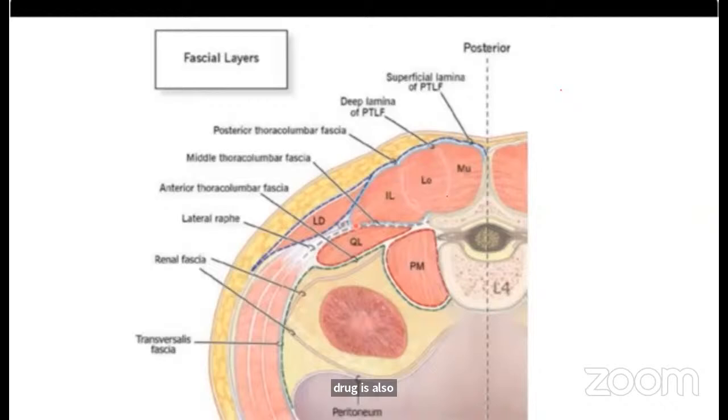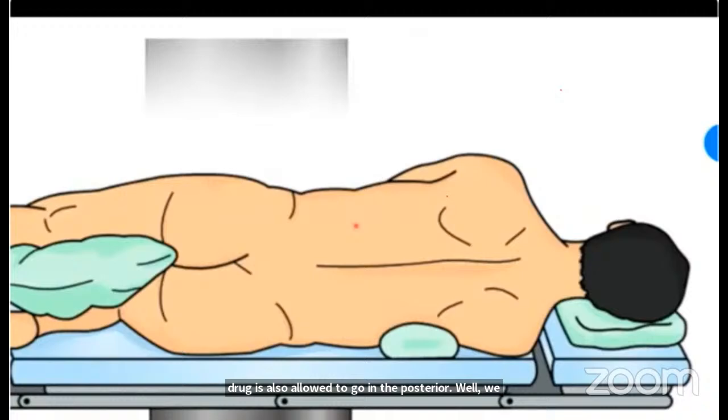This block, I usually tend to prefer in the lateral position, but it can be done in the supine position with a little wedge or some support under the hip area. And the preferred probe for this block is the linear probe, because with a linear probe we can very easily see the spread of the drug. And this is how Dr. Rafael Blanco is also doing this block with the help of a linear probe. If you want better success, I think the linear probe is the key.